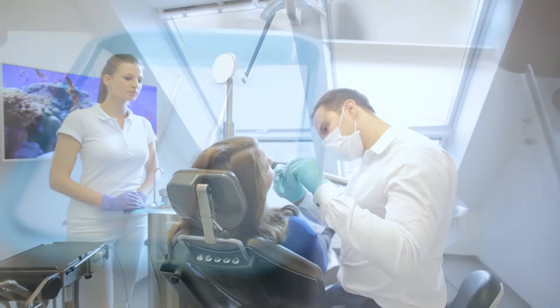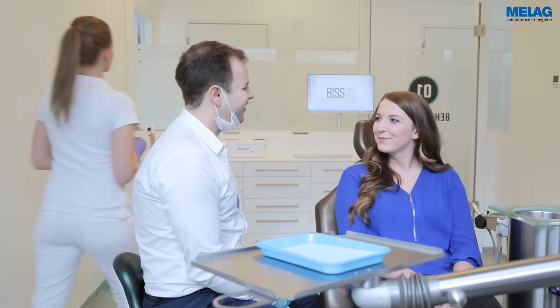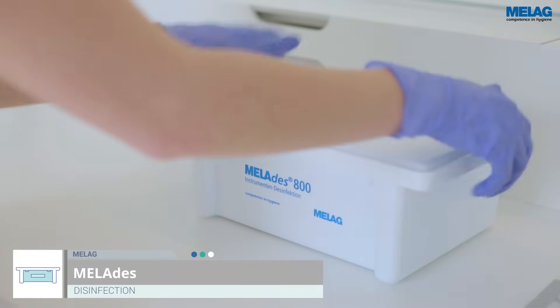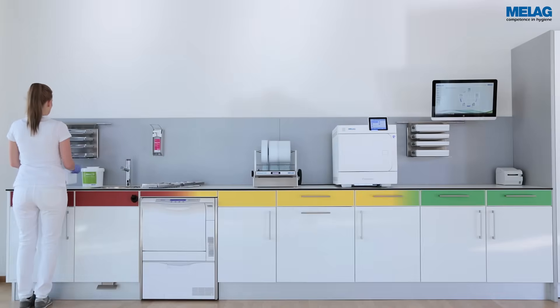Safe instrument decontamination is the hygienic basis for the safety of patients. The MeLag system solution ensures the highest levels of efficiency and maximum safety. Countless practices profit every day from our aligned products for cleaning and disinfection, packaging, sterilisation and documentation.